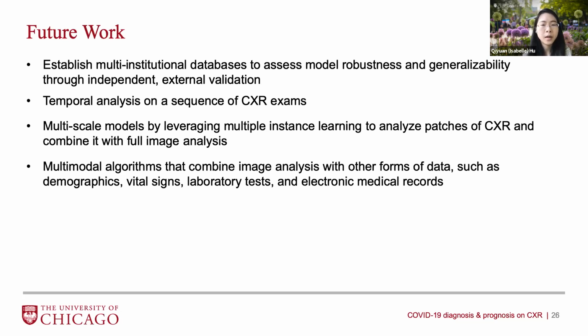And we can also investigate temporal analysis on a sequence of images to take advantage of patients' previous CXR exams instead of only using a scan at a single time point. We can also work on multi-scale models by leveraging multiple instance learning to analyze patches of CXR and combine it with full image analysis. And finally, we can work on multimodal algorithms that combine image analysis with other forms of data, such as demographics, vital signs, lab tests, and EHR records.